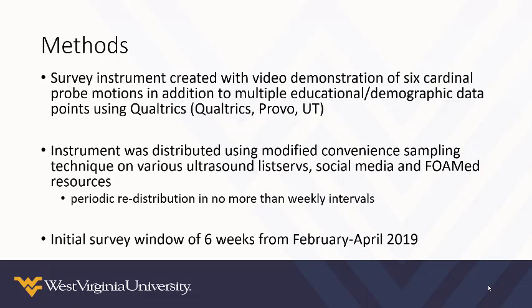In order to better understand the terms used by sonographers and physicians in the field, we developed a survey instrument which had a video demonstration of the 6 cardinal probe motions. In addition to this, we collected educational and demographic data using the Qualtrics software.